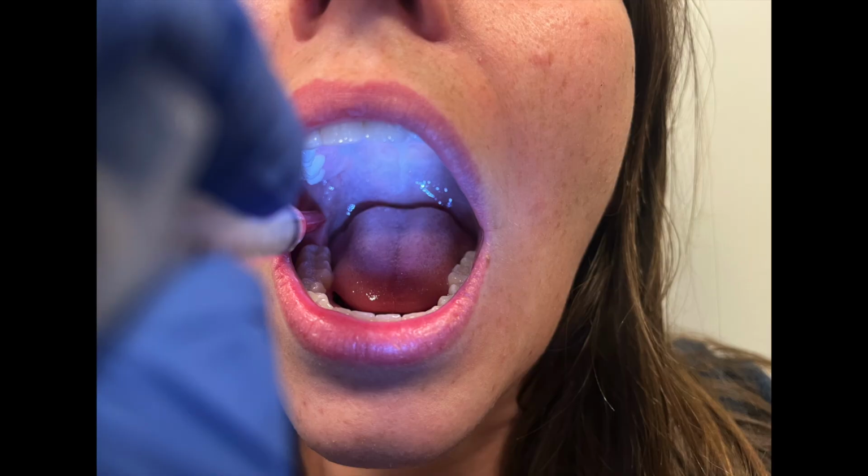The injection site is about 1 centimeter above the molar. Touch the bone with the needle tip, then back off slightly, aspirate, and inject 2 mL of anesthetic.